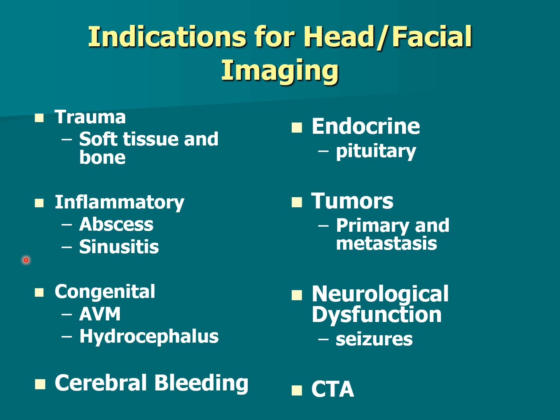Cerebral bleeding, we know that we certainly can do that to try to see any kind of bleeding in the brain. Endocrine studies, well, that's going to be looking at the pituitary gland. CT is great for looking at the sella turcica, the bony structure, from the sphenoid bone that houses the pituitary gland, and then also to see the pituitary gland. Follow-up studies might be used to see the gland itself with an MRI.